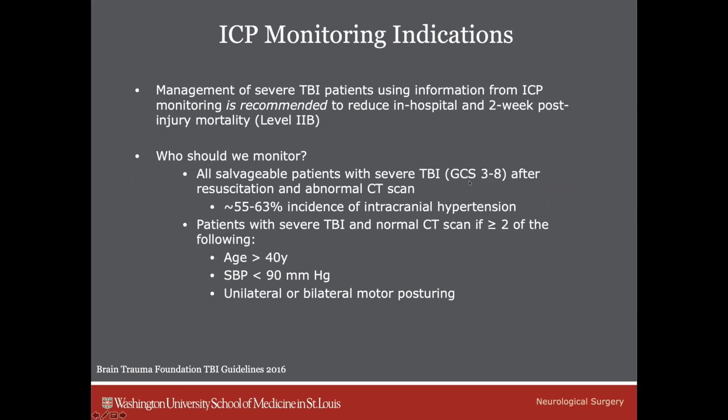So what are the indications for monitoring ICP? There are Brain Trauma Foundation TBI guidelines that were published over a decade ago initially, and then they've been updated recently. The extensive guidelines were updated in 2016, and then a recent update was performed in 2020 after a randomized controlled trial of decompressive craniectomy. I'll be referring to these guidelines for recommendations and management from here on. The first thing is these guidelines recommend ICP monitoring to reduce in-hospital and post-injury mortality in patients.